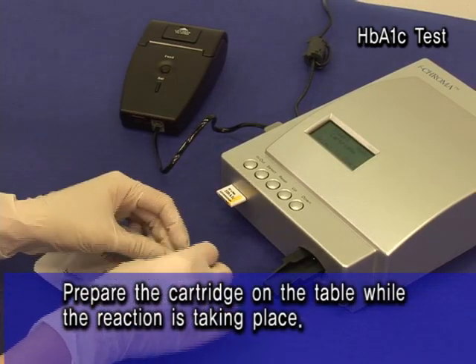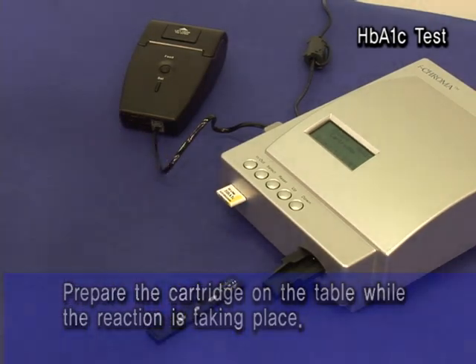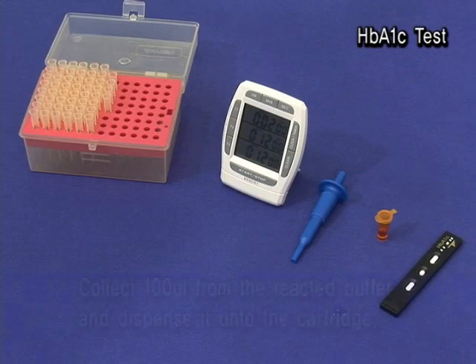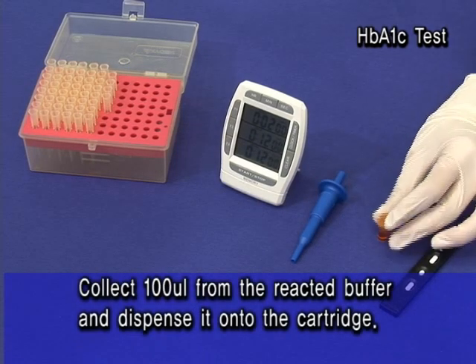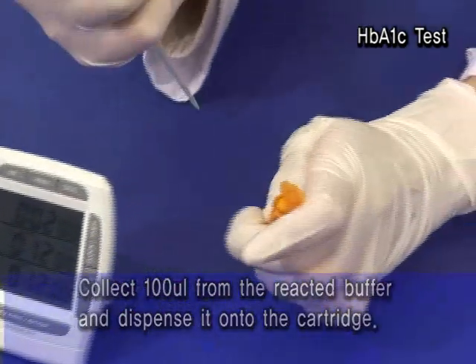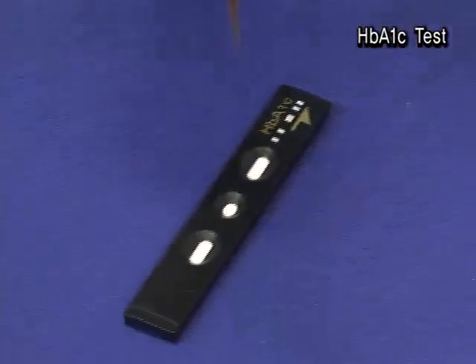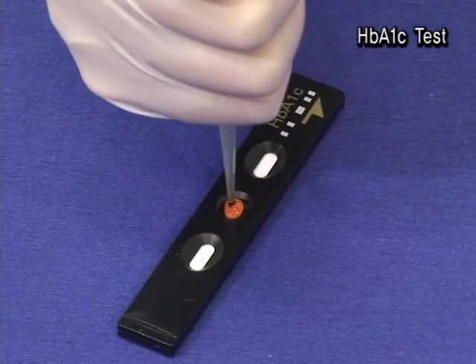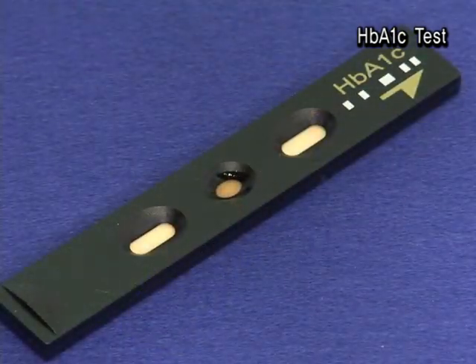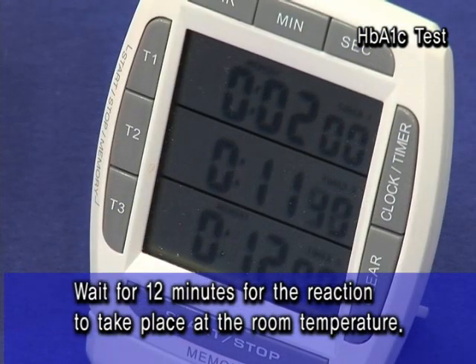Prepare the cartridge on the table while the reaction is taking place. Collect 100 UL from the reacted buffer and dispense it onto the cartridge. Wait for 12 minutes for the reaction to take place at room temperature.